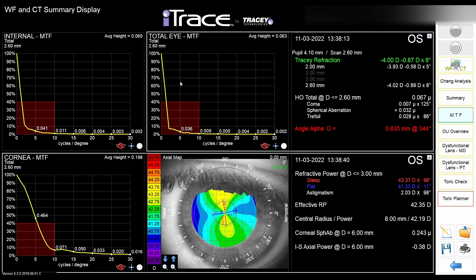Now let's talk about the MTF — Modulation Transfer Function. This is a graph that shows how contrast sensitivity differs and changes with the size of letters. The percentage is the contrast, and the x-axis shows the size. There is a red danger zone at 40% contrast and 10 degrees of arc. If the patient's yellow curve falls within this danger zone, it means they're not a good candidate for premium IOL.